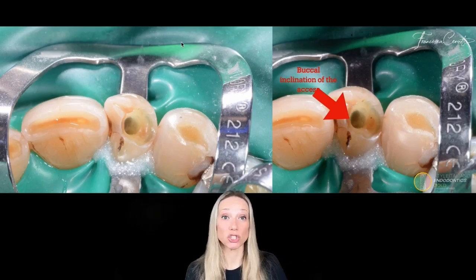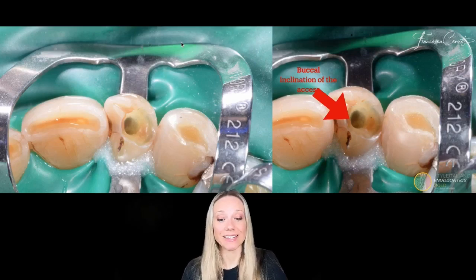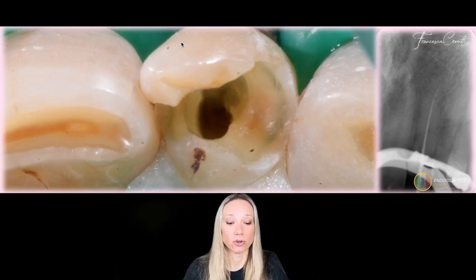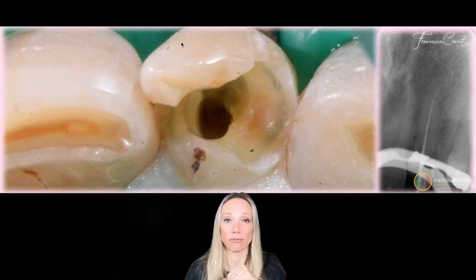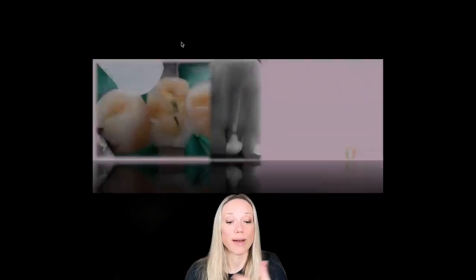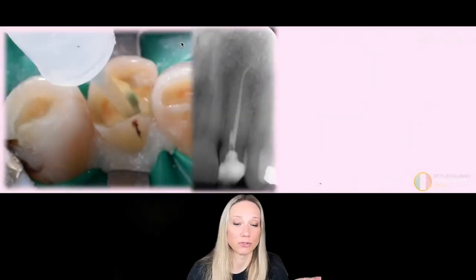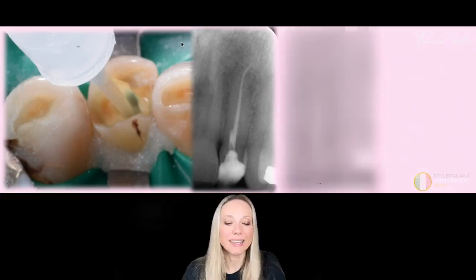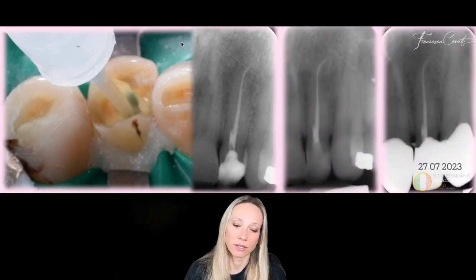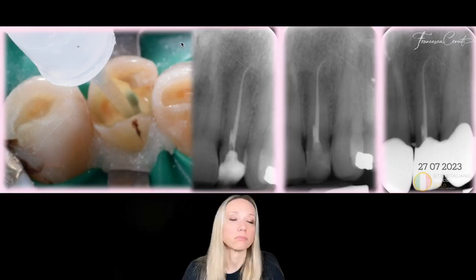And in this case, you could also correct, for example, as I did, the inclination of the access, and so put it in the correct direction for my files to enter. This was no easy case because it's very thin, calcified, etc. I had to drive with my hands the rotary files at a certain point just to arrive to the apex, because you know that the lateral incisors have also a nice distopalatal curvature in the end of the root, so they can be difficult to treat, but eventually I made it.